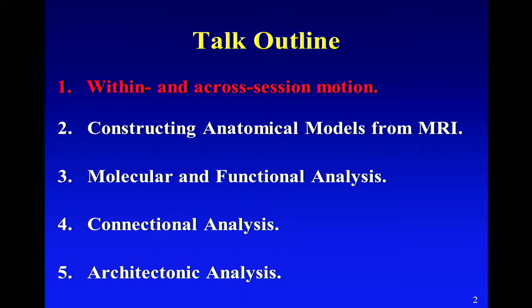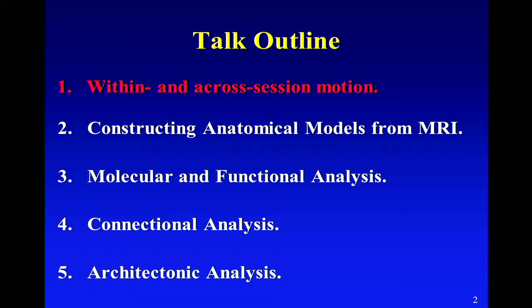And this is a particularly awful confound because it's almost always the case that motion is correlated with what we're interested in, right? Little babies move more than older kids, and people who are going to get Alzheimer's move more than controls, and elderly move more than young. And so we're left in this position where the thing that is corrupting our image is correlated with the thing that we want to study. And so we've worked a lot on trying to remove motion both within and across session.